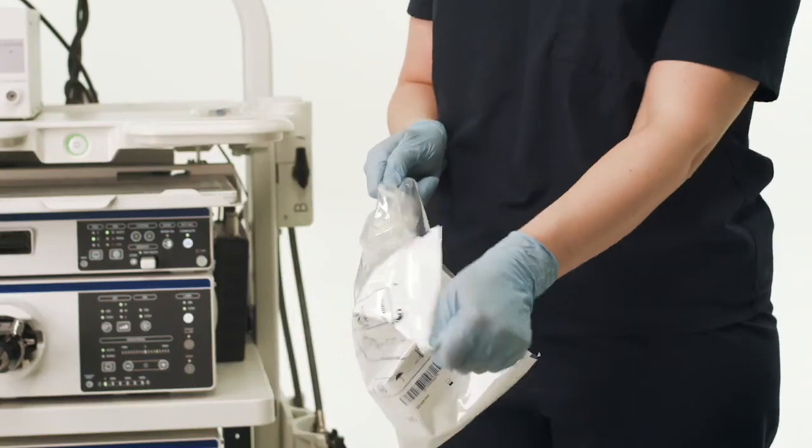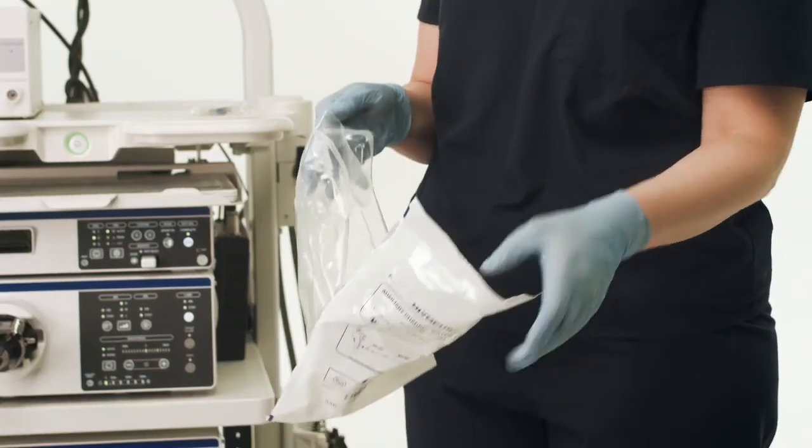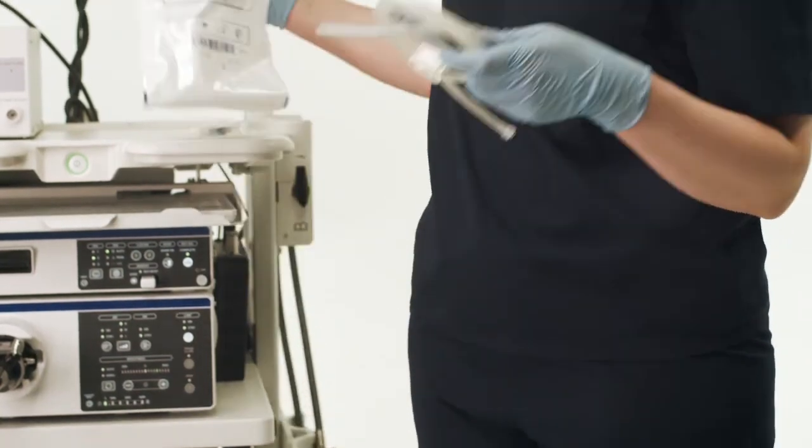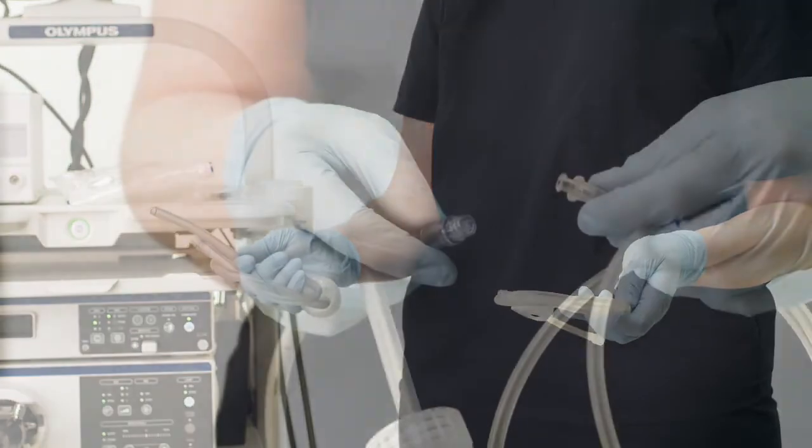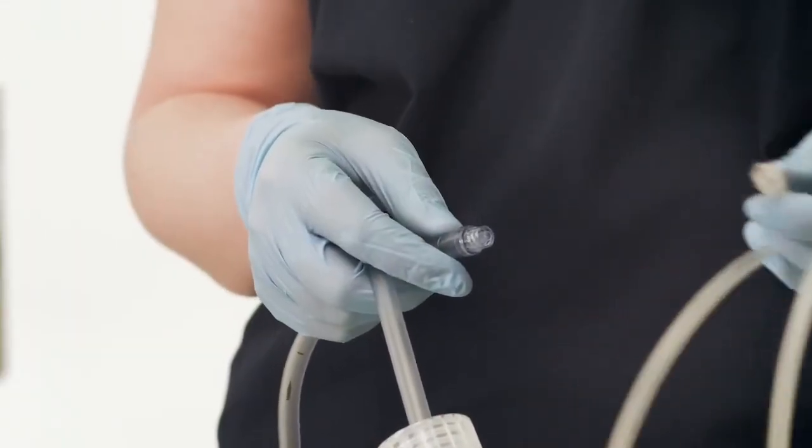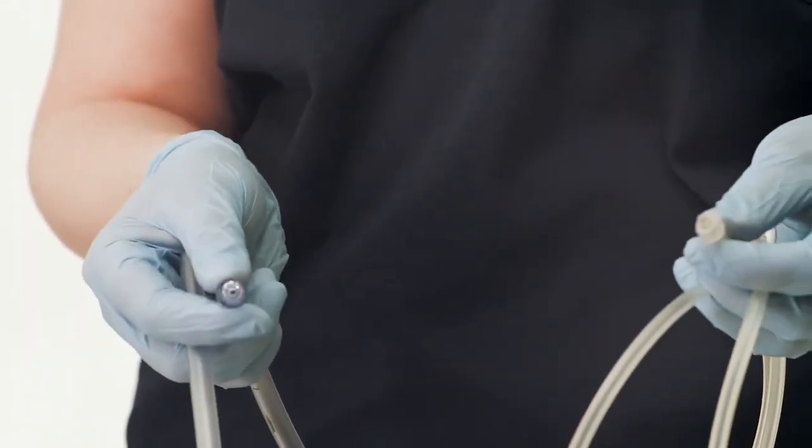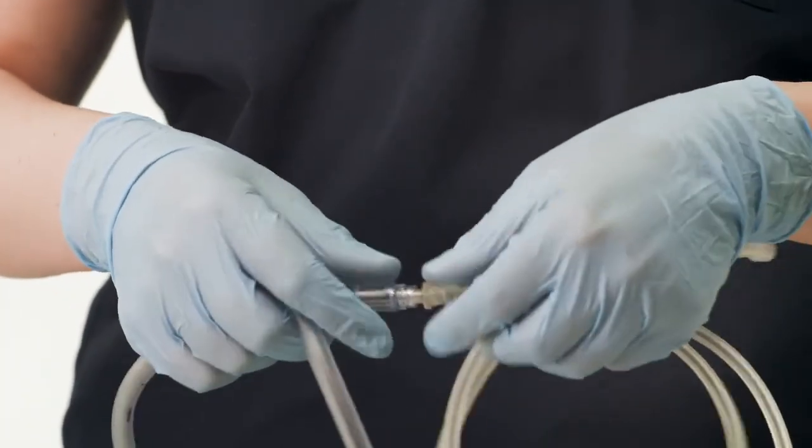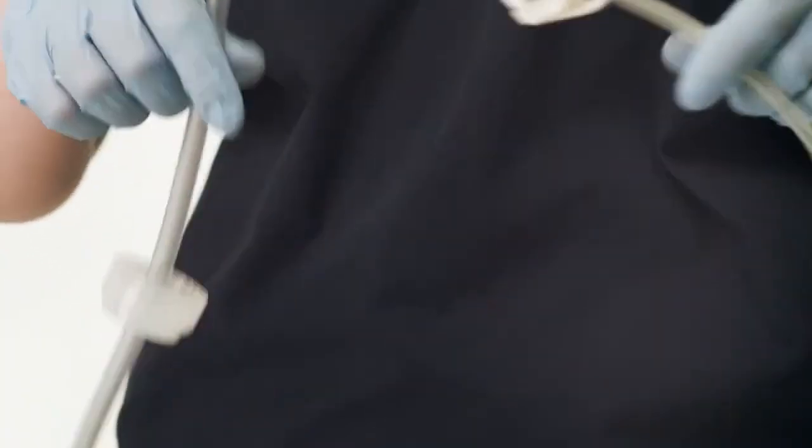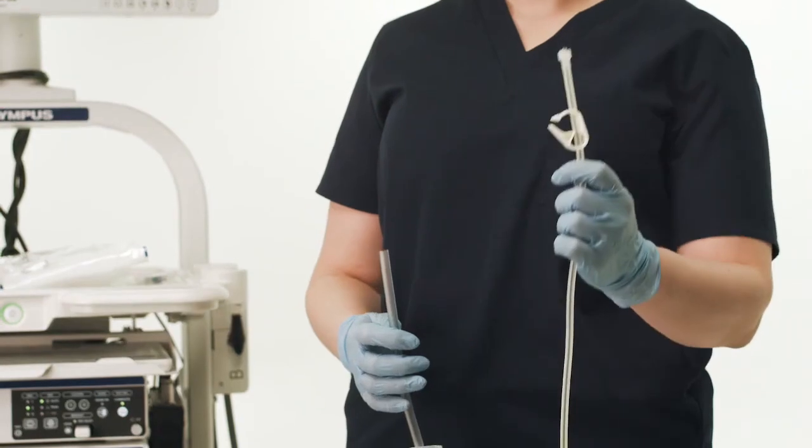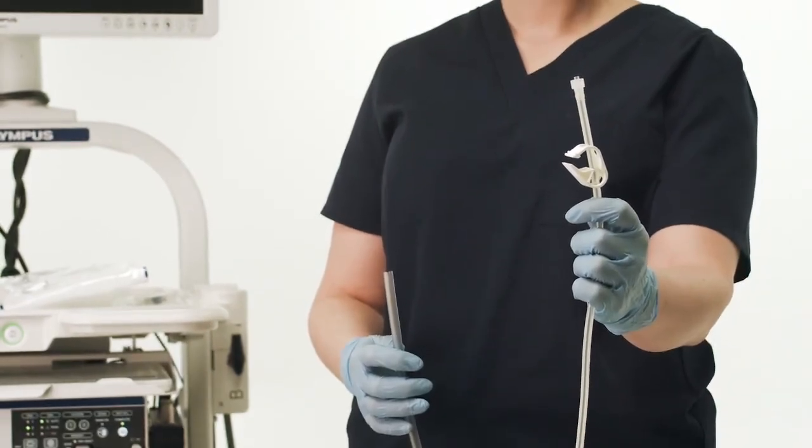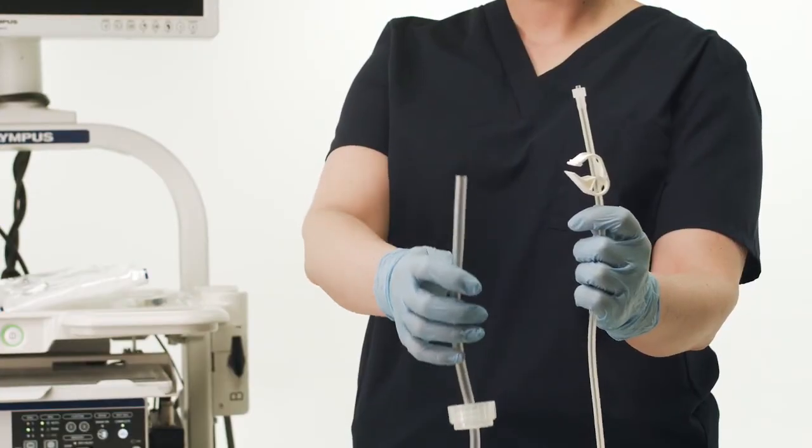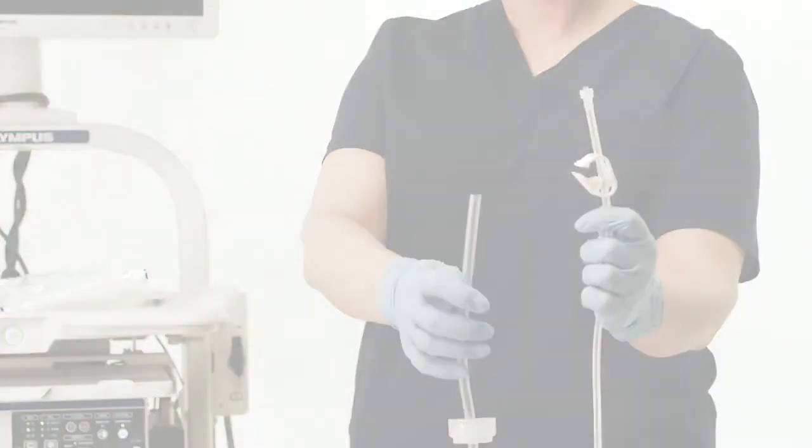First, open the MAJ 1651 sterile packaging and remove the two components of the auxiliary channel tube set. Locate the lure connectors on each tubing section and attach the two separate tubing sections to create one long tube. The tube's pinch clamp should be located on the tubing section ending with a lure connector with the scallop cut tube on the opposite end.